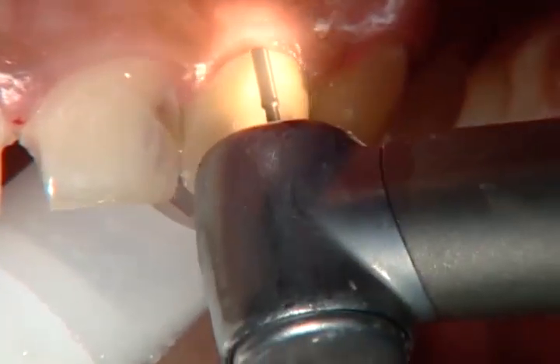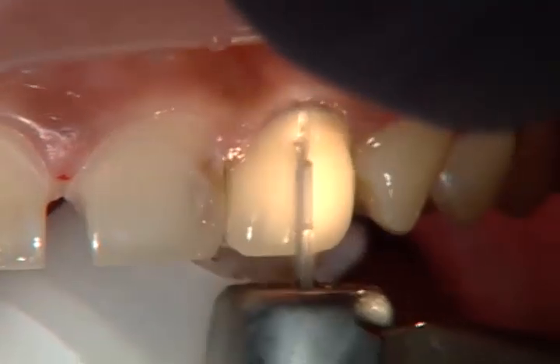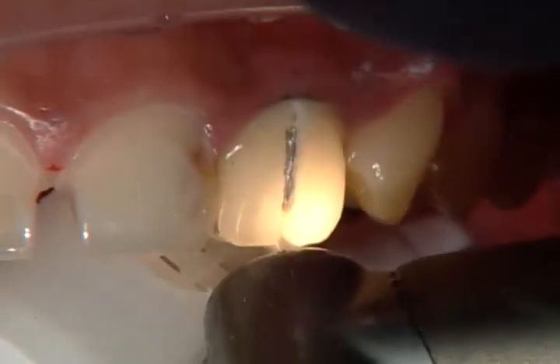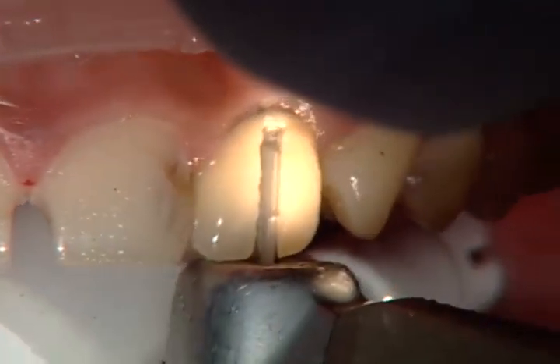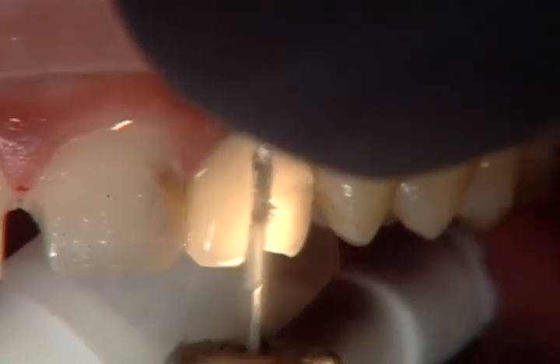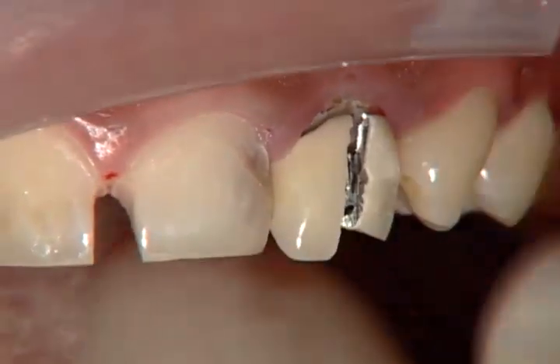And this is a razor burr from Axis Dental. And I love this burr. This burr will fly through porcelain and metal on any crown in just a matter of seconds. It's by far the fastest and the safest way to cut through PFMs, amalgam, any old restorations. The only thing this won't work on is zirconia. So once we use this razor burr to make a slice through the facial, I take my crown remover, give it a little twist, and we've got it off and we're down to our preparation.